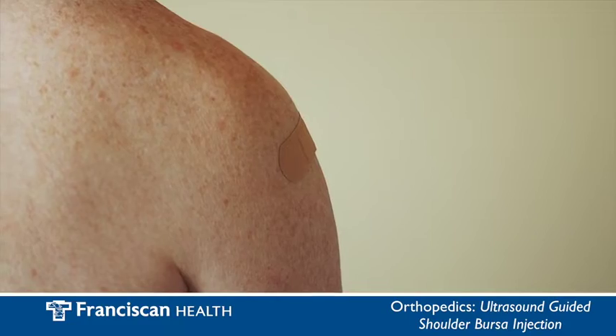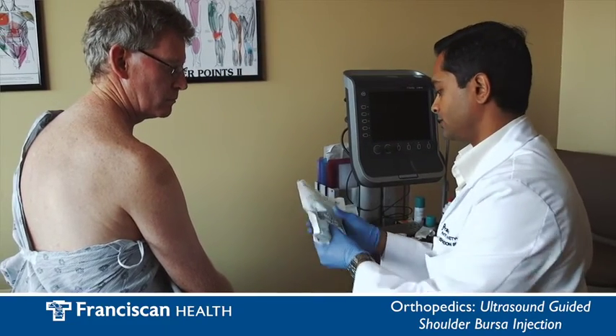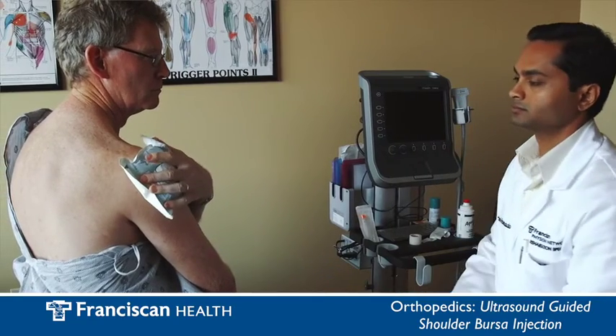Following the injection you may have increased pain for about a day or two. This is typical and completely normal. Ice packs as well as ibuprofen or another approved anti-inflammatory pain medication is recommended. This was a demonstration of an ultrasound guided shoulder bursa injection.